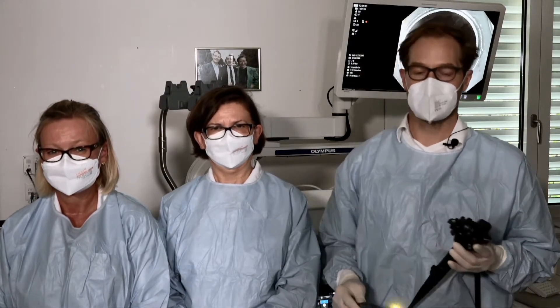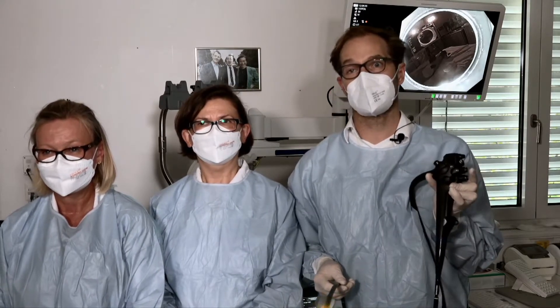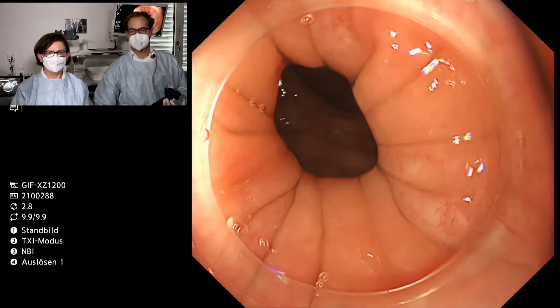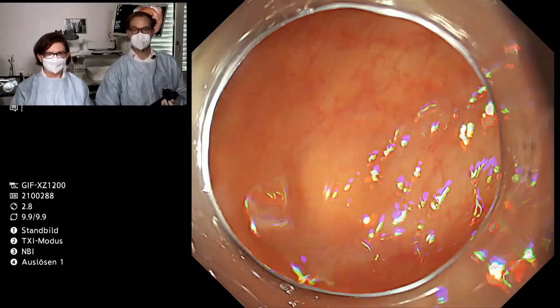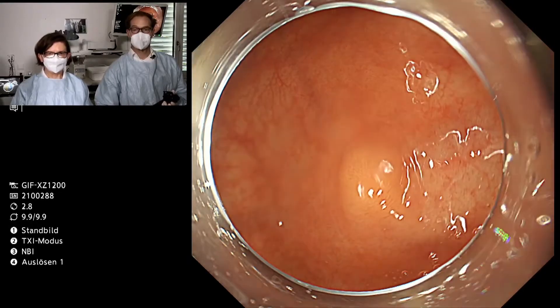Our first scope we prepared is an Olympus GIF-XZ-1200, the zoom gastroscope. We'd like to present the case and the lesion with this endoscope. Coming from the anal channel, the lesion is located around four or five centimeters above the anal channel, and you can see it nicely with a normal mucosal pattern.